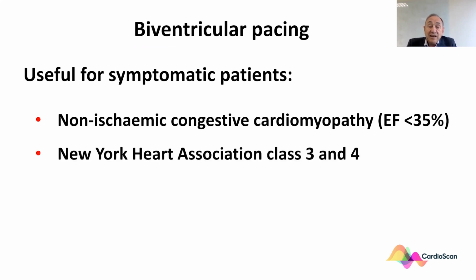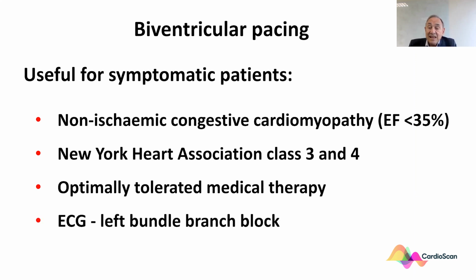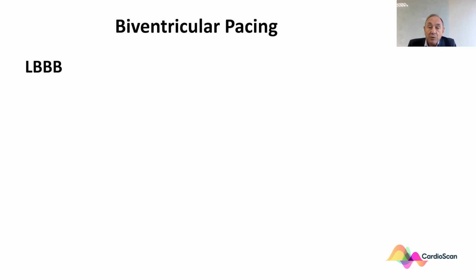The patients need a New York Heart Association Class 3 or 4. They have to have had optimally tolerated medical therapy, and the ECG shows a left bundle branch block. Let's discuss left bundle branch block.